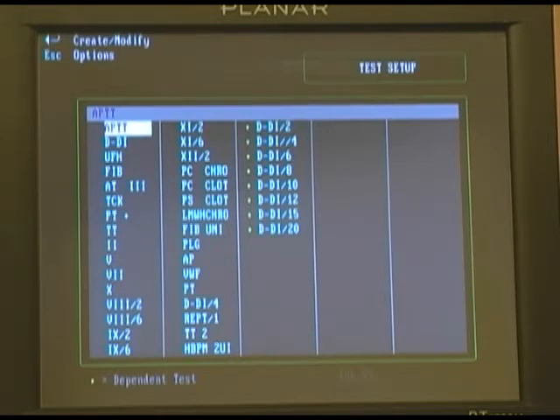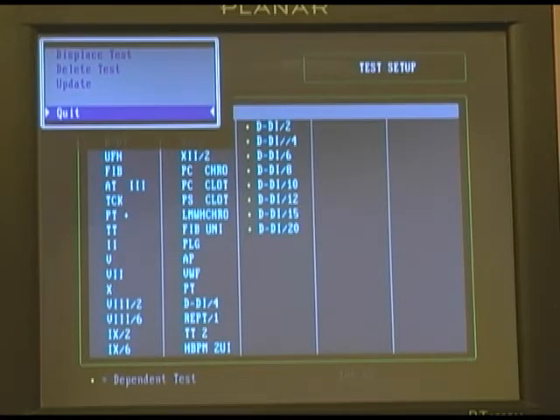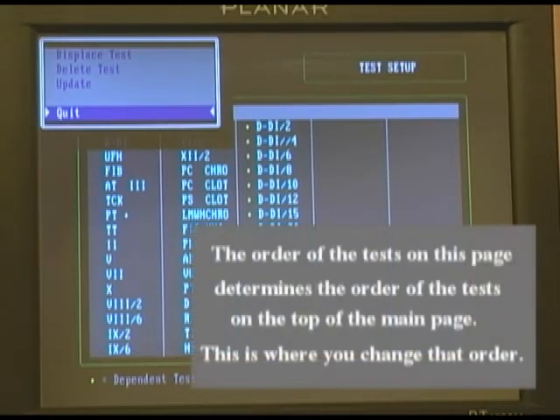If you hit Escape, your options are to displace a test. This will allow you to move a test forward or back so that it can be displayed on your test status screen in a more convenient location.